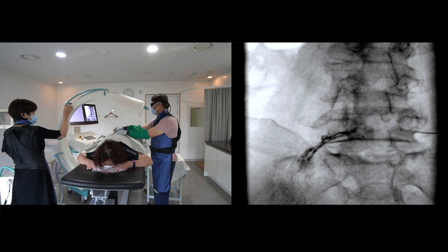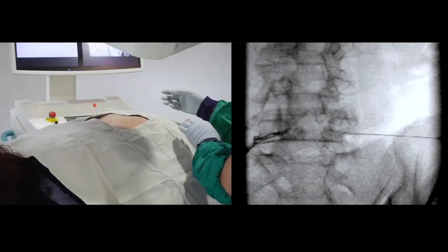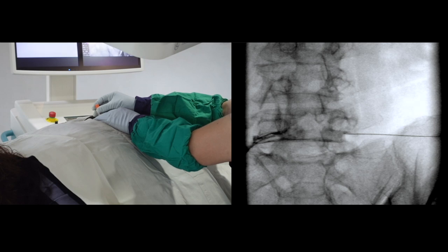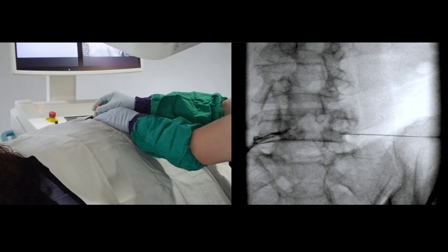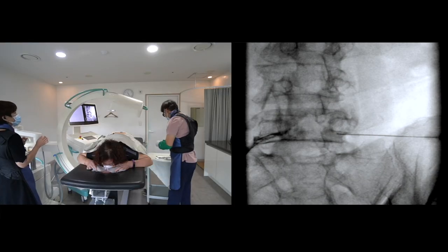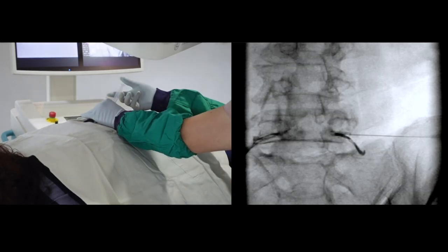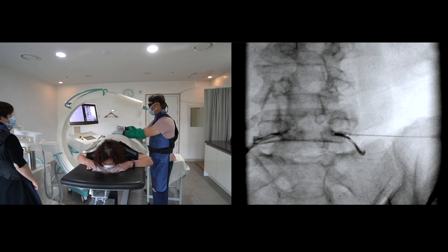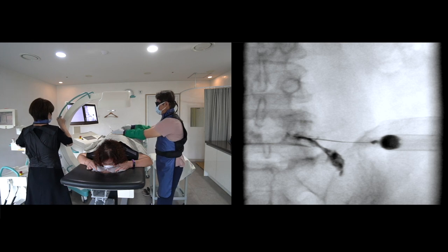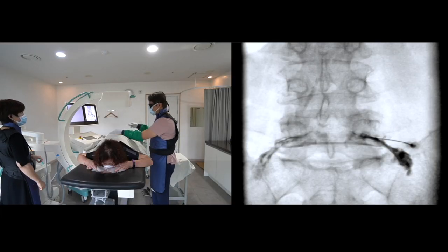I ask to rotate the C-arm to control the lateral oblique view. The inferior border of the pedicle is clear. The inferior border of the transverse process is clear. Let us check the contralateral oblique AP view — does the contrast pattern look like a mustache?